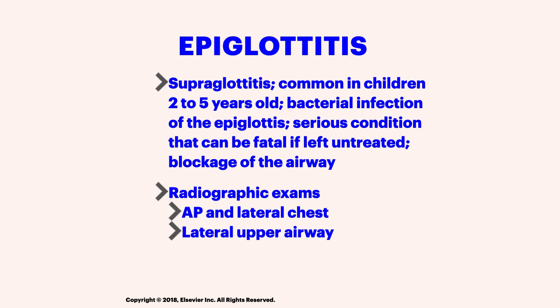Epiglottitis, supraglottitis, common in children 2 to 5 years old. Bacterial infection of the epiglottis, a serious condition that can be fatal if left untreated, blockage of the airway. Radiographic exams include an AP and lateral chest and lateral upper airway.